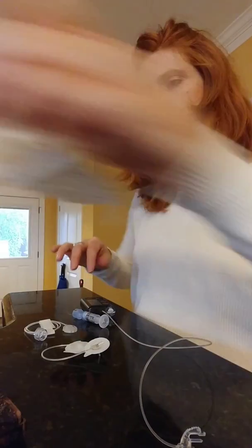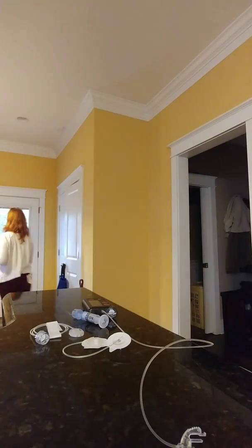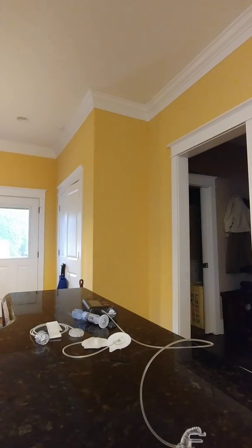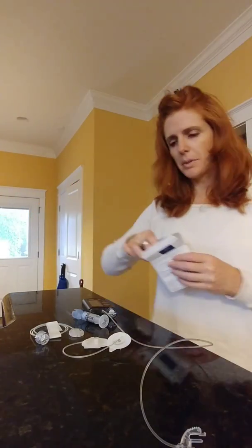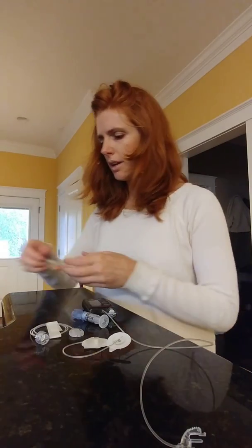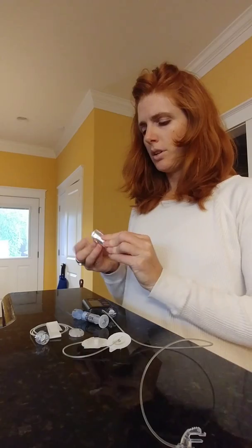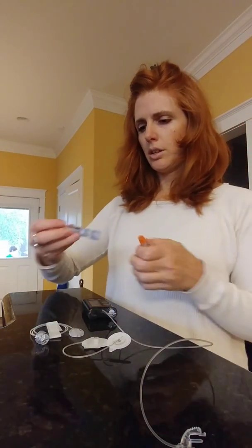Alright, so I clean my surface first, took everything out of the package. I'm going to grab the insulin from the fridge. And so I'm just making sure that the insulin I grabbed is the soonest expiration date. I'm going to take the insulin out. Oh, and my hands are clean as well.